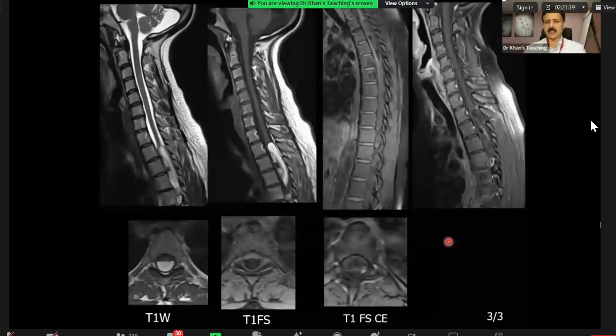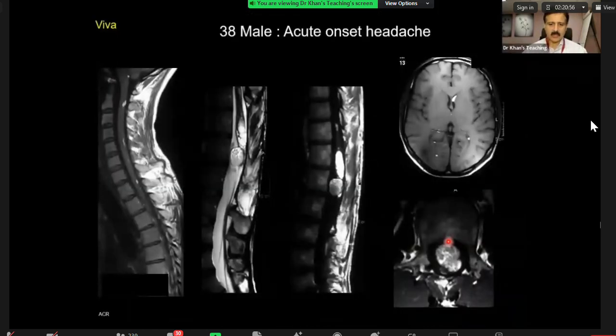But other people think that at times some enhancement might be seen in a dermoid, but actually most people think that this might be a teratoma. Teratoma per se is not an exam case. The point is that if you pick up a fatty thing, that's fine, because teratoma will have multiple other layers also. This is the type of scenario which will come in the exam.